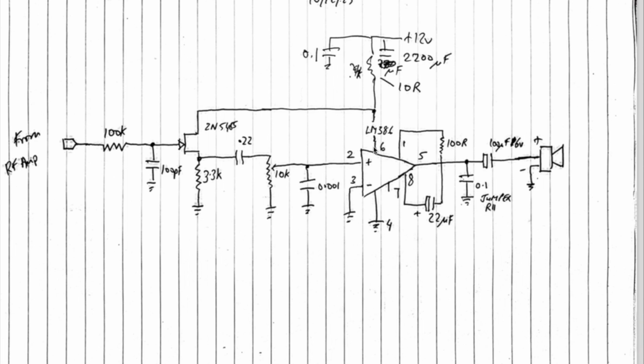But this capacitor and this 0.1 microfarad decoupling capacitor really have to be right close to this power leg as possible to avoid this thing going into self-oscillation, because the whole crux of this Doppler receiver is it really relies on amplification of the audio more than anything else. So this part of the circuitry is quite crucial. When you do it, you have to mount it on a ground plane, and keep all the leads as short as possible to avoid it self-oscillating. So that's more or less the circuit.